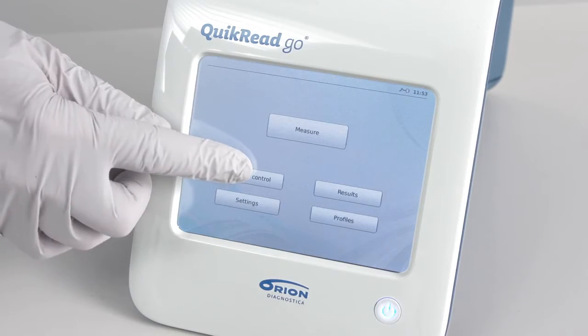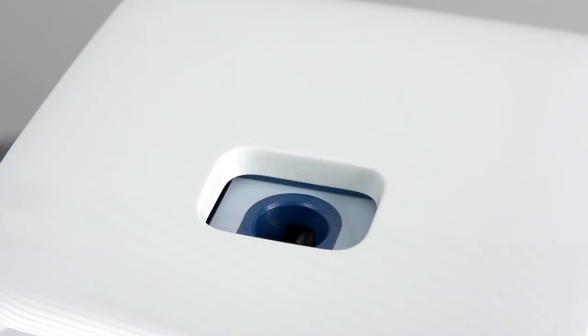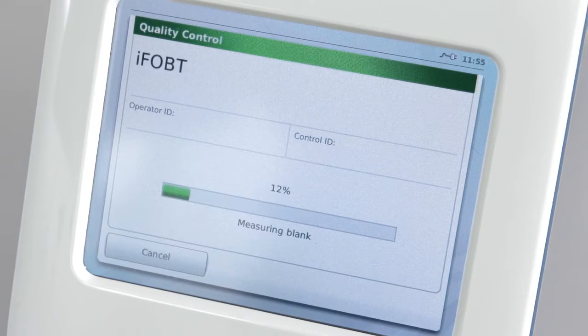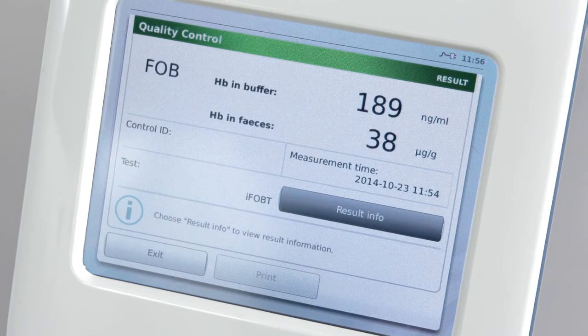Choose 'Quality Control' from the display of the QuikRead Go instrument and follow the instrument screen for instructions. When the instrument guides you, insert the cuvette into the measurement well. The instrument starts measuring the sample and you can follow from the screen how the measurement is proceeding. The test in use is also shown on the screen. When the measurement is completed, the result appears on the screen — qualitative or quantitative. The results are automatically stored in the instrument memory.